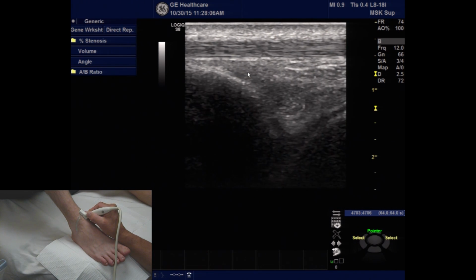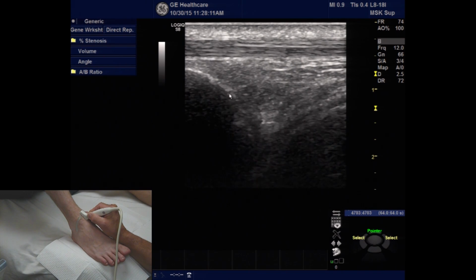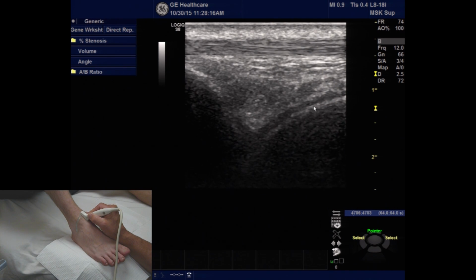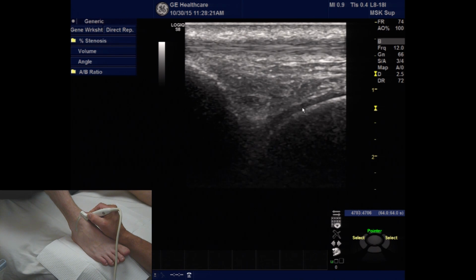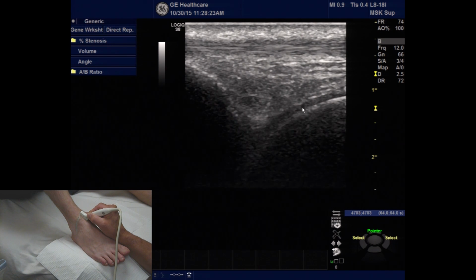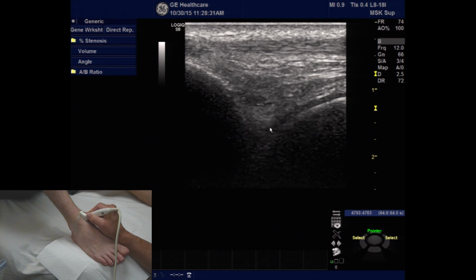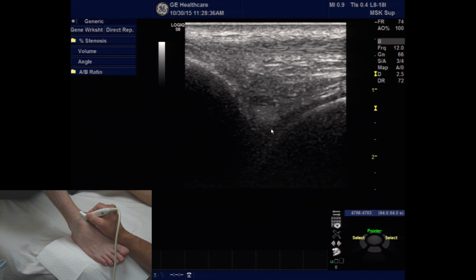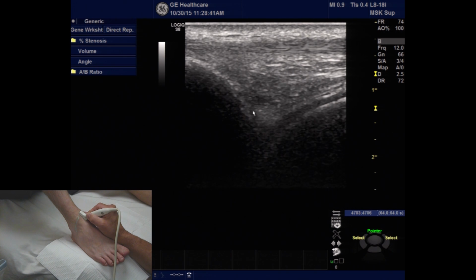Sliding the transducer towards the toes, the distal end of the tibia will fall away, and we'll see the typical shape of the dome of the talus with the articular cartilage sitting on top of, or adjacent to, the dome of the talus. In this point of view, the wedge-shaped structure sitting between the tibia and the talus is the fat pad, a common area for collection of fluid and for impingement from spurring coming off the distal tibia.